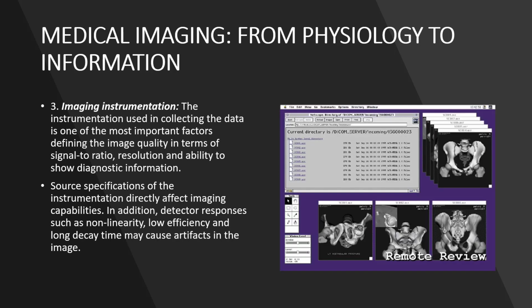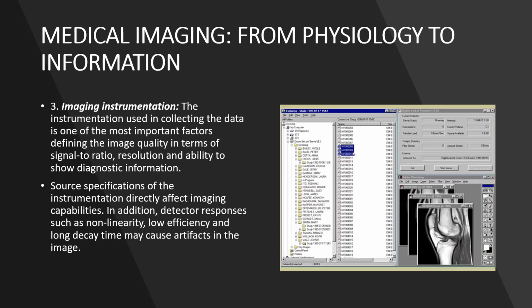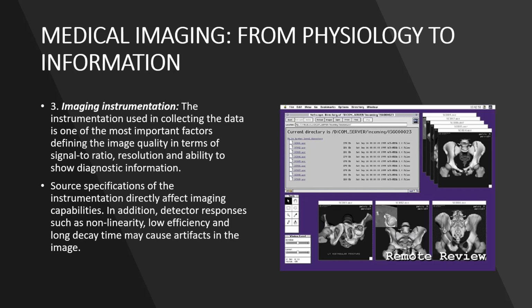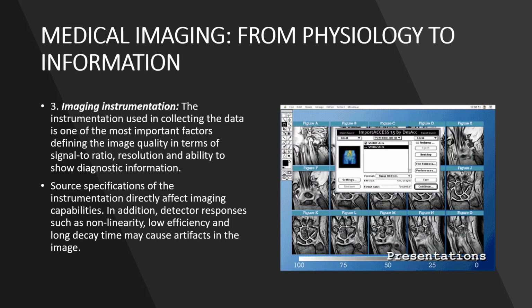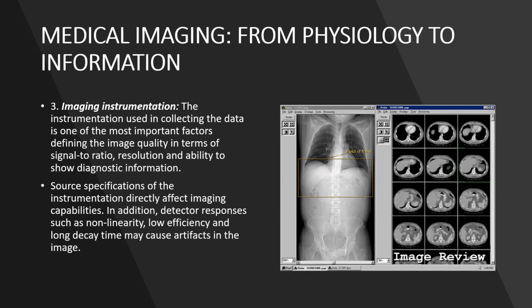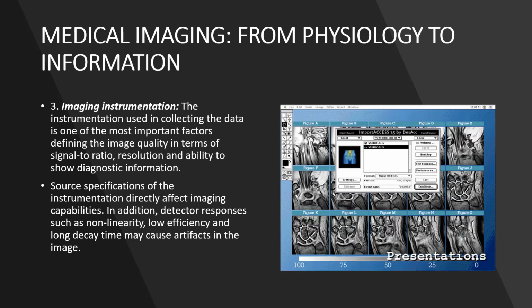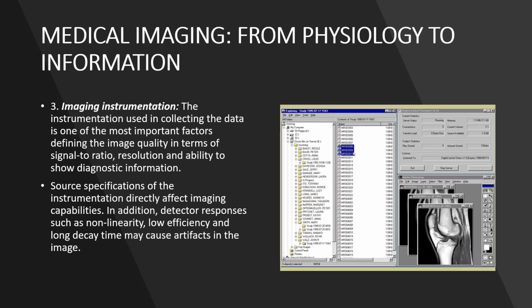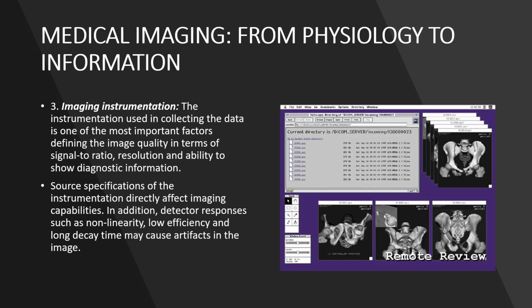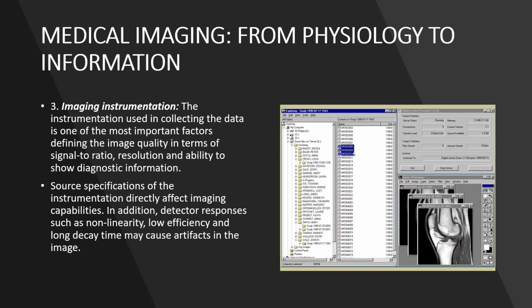So what we're looking at here is we have to know how the detector interacts with the ionizing radiation and what are the properties and capabilities of that image detector. In addition, we need to know if the equipment itself can generate the type of imaging data from the primary beam. Do we have enough power? Can we collimate? Do we have the distance correct? Is the patient's... All these things come into play when we do a portable examination. It takes time to set up an examination and do it correctly.